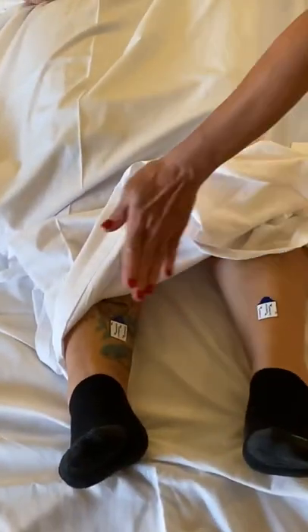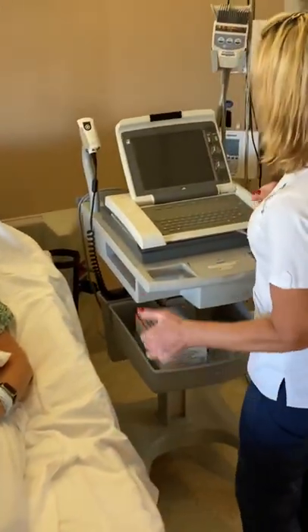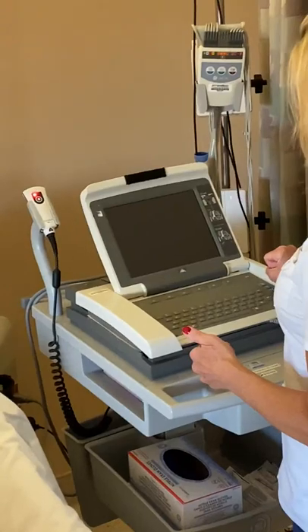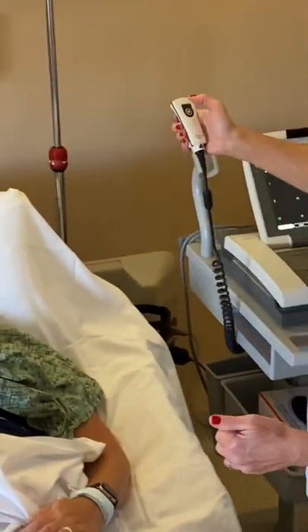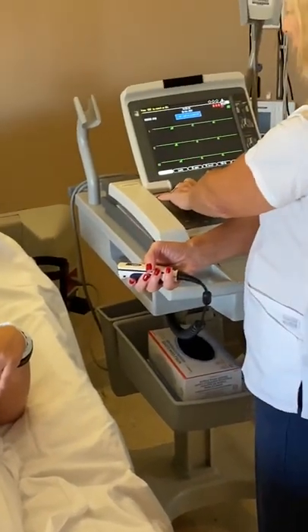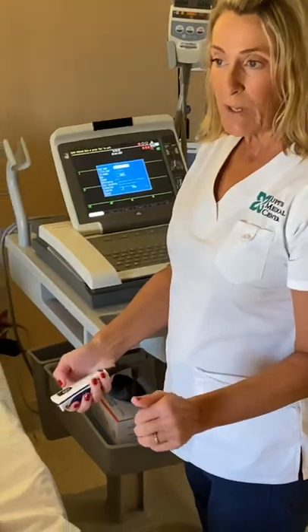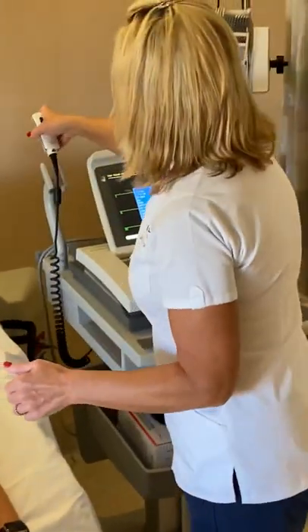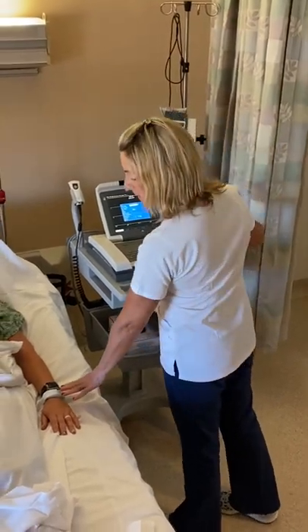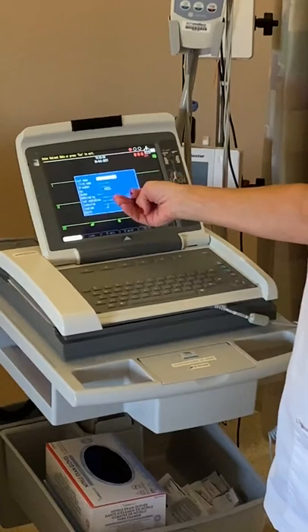1, 2, 3, 4, 5, 6, left leg, right leg, left arm, right arm. To get the machine to work and record the individual's EKG, you power on. 90% of our EKGs at Jupiter Medical Center are equipped with a scanner. So use the scanner button, you'll hit patient data, and then you will scan the patient. If you do it correctly, you will hear a ding. If you do it incorrectly, you will hear a buzz. Once you have successfully scanned your patient, you'll confirm that the data on the screen matches the data on the patient's wristband. If you're unable to scan the patient's wristband, you can enter the data manually.